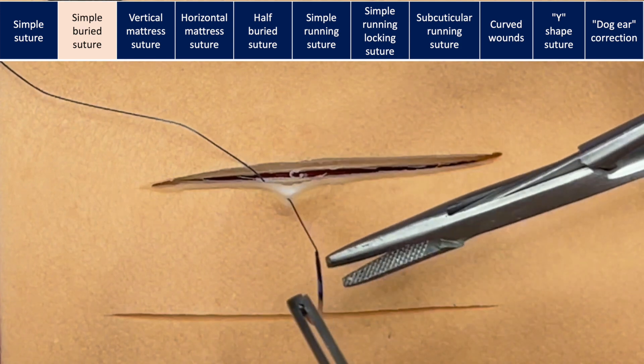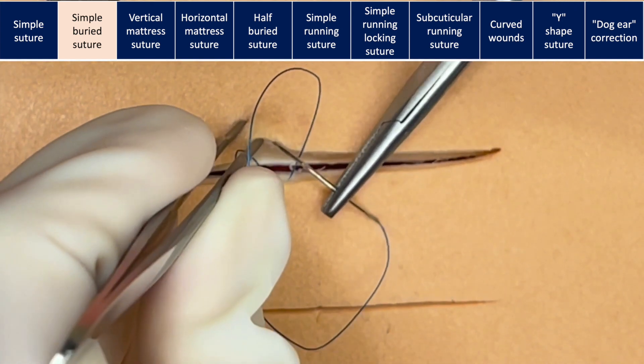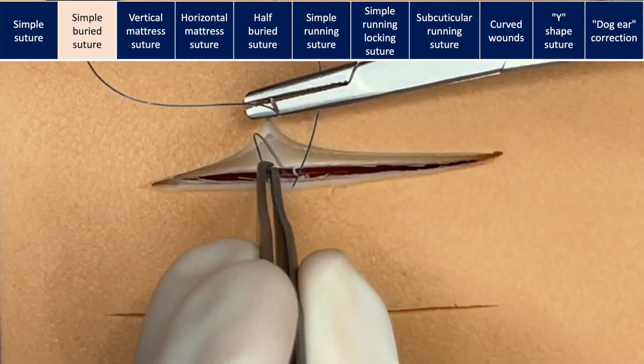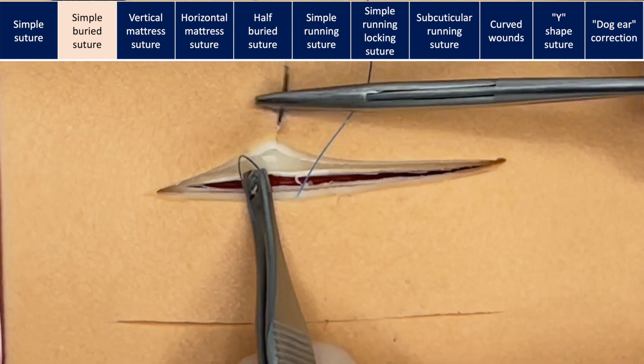On the opposite side, we're going to do the opposite — we're going to go superficial and then deep. Make sure you are entering the same place where you exit on the other side: just as superficial as you are on one side, you must be superficial on the other side.